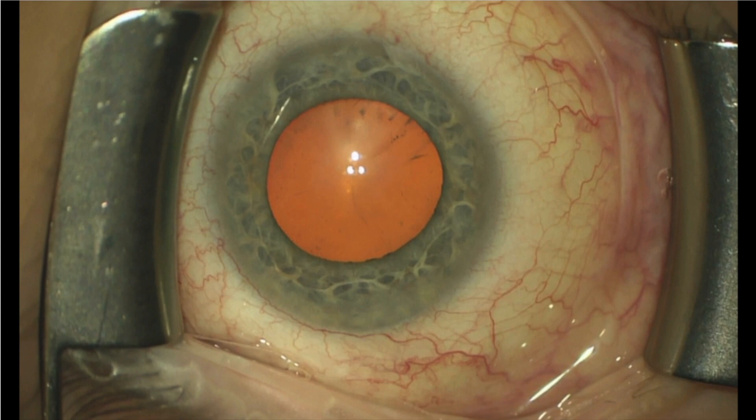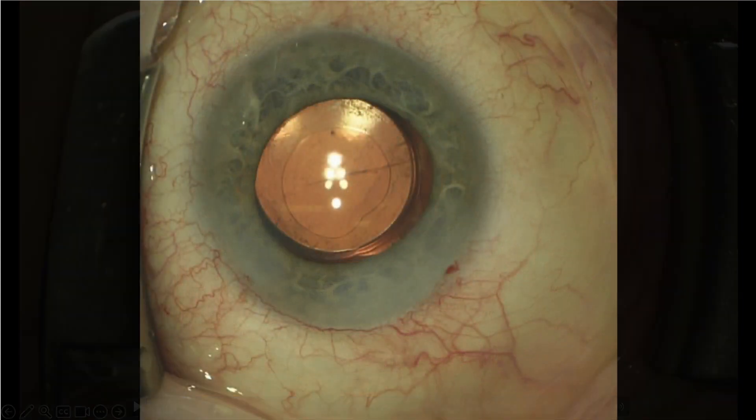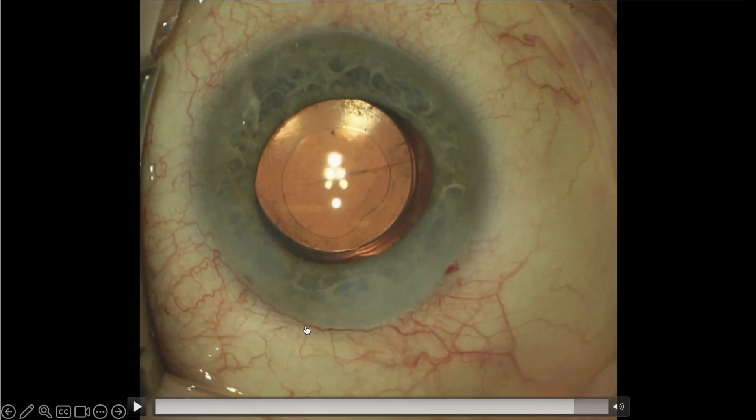This is an image of the eye before surgery was started, so you can see what the episcleral veins look like with no blanching for 360 degrees. Now compare that to this image — there are several areas of blanching of the episcleral vessels, indicating communication between the anterior chamber and the episcleral venous system.